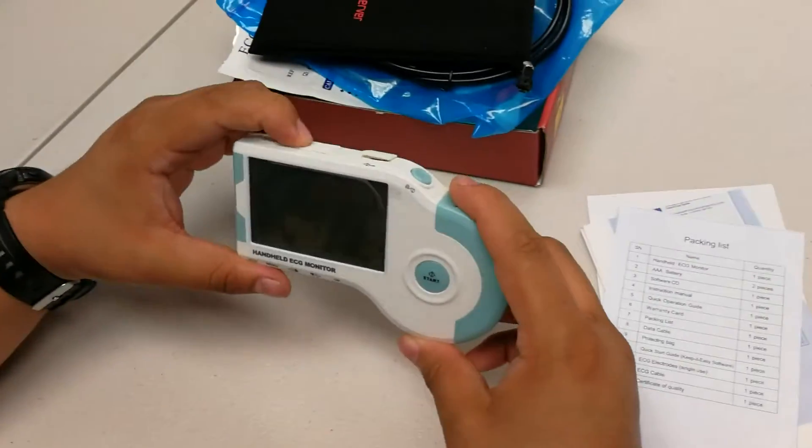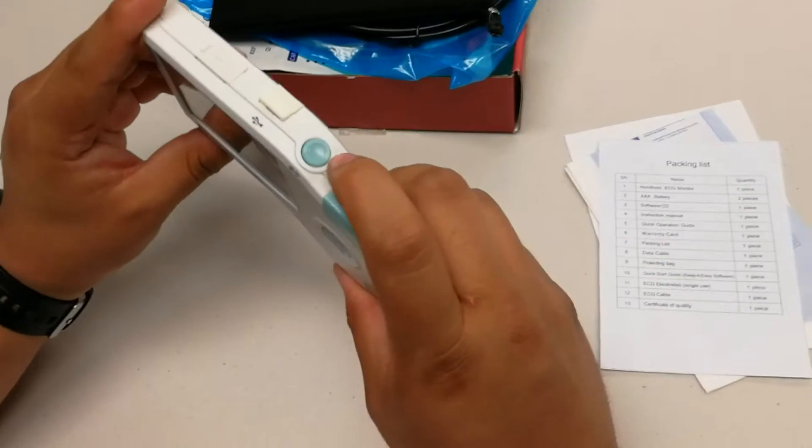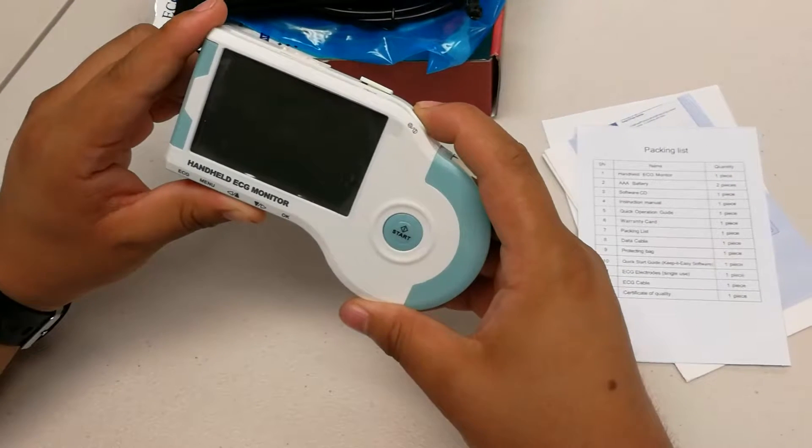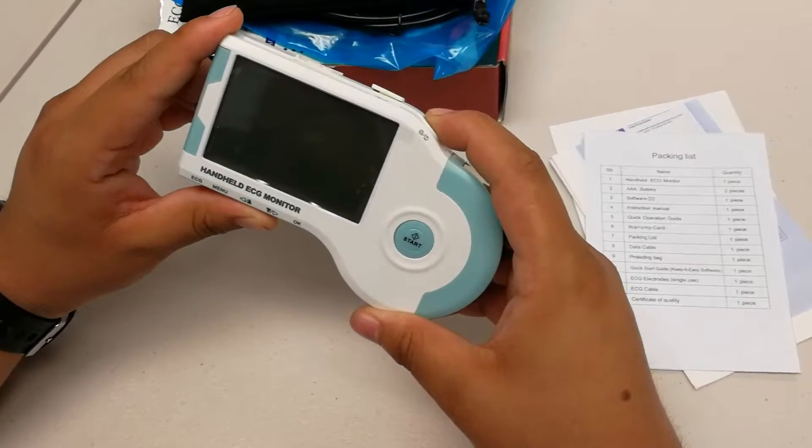To begin using the item, please press the start button and hold — should be about three to five seconds.